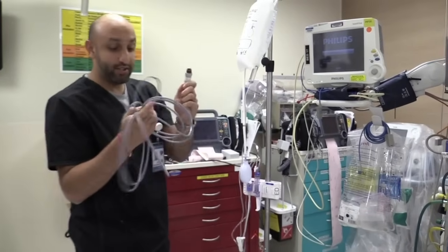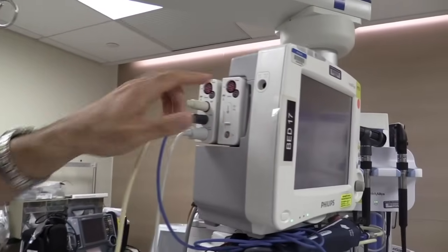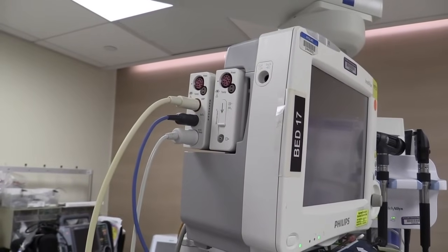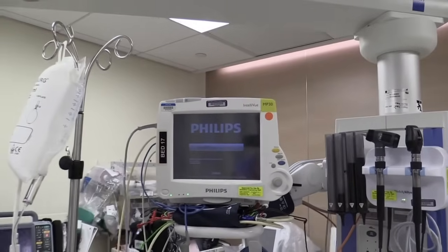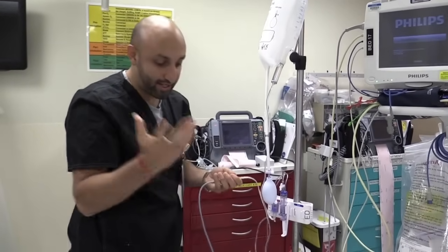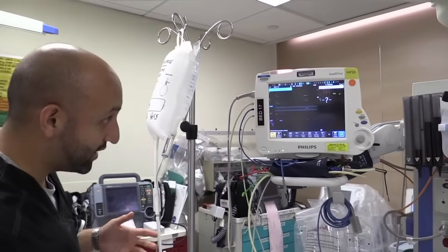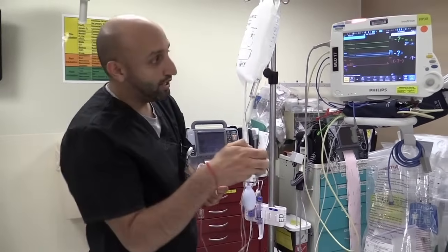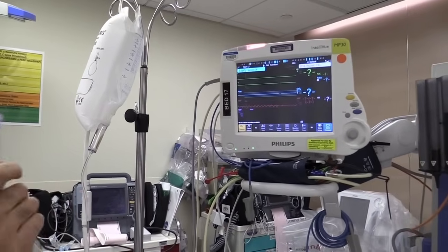This port is going to connect to our monitor. There are actually two ports on the monitor where you can place this. I'm going to place it in one of the ports on the left side — the right side is essentially for CVP monitoring oftentimes. The other end you're going to connect right onto the actual arterial transducer itself, and that clicks in very easily. Now our monitor is on. If everything is connected appropriately, if you take the part that goes into the patient and wave it around, you should see on the monitor a little bit of artifact — that means everything is hooked up and connected correctly.